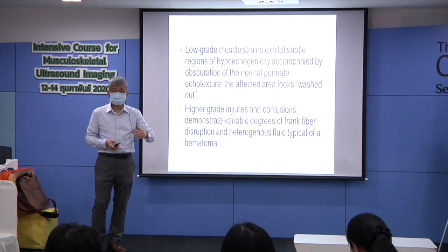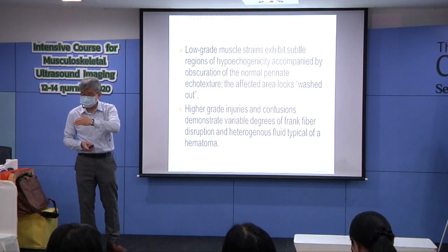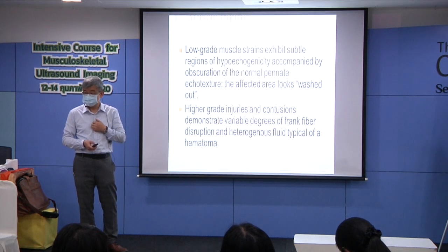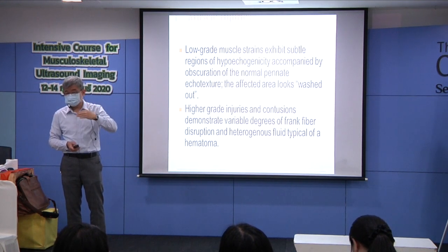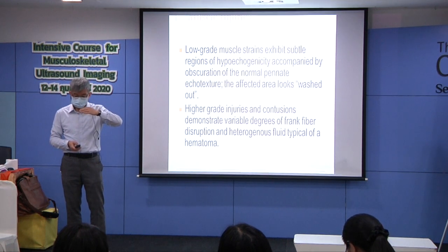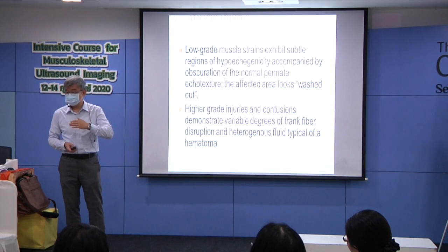And you found a hypoechoic region with discontinued fascicles, then you suspect this may be the location of muscle injury. I might agree with you. But without clear skin, fat, superficial aponeurosis, fascicles, pennation angle, deep aponeurosis, fat, the fat between muscle and the bone, without these clear borders and lines, you can't do anything.